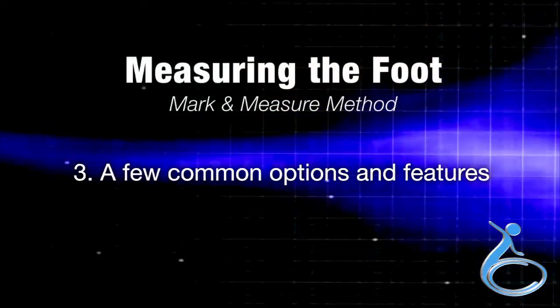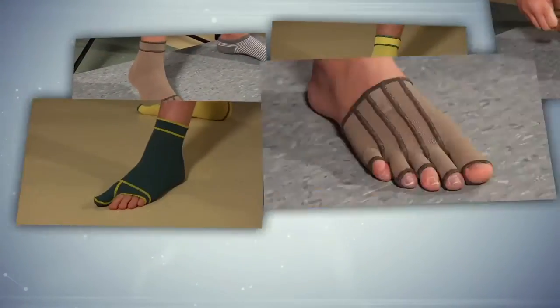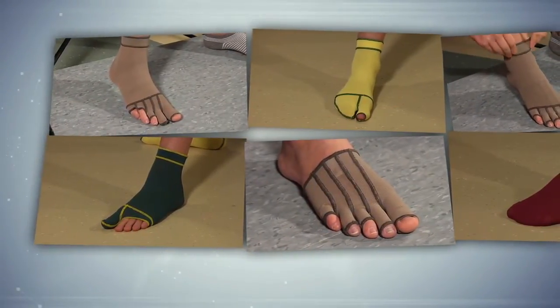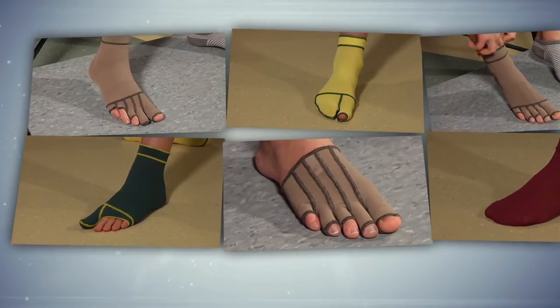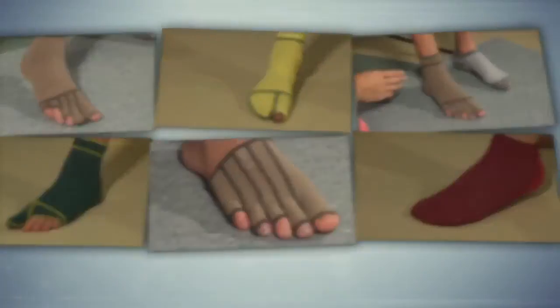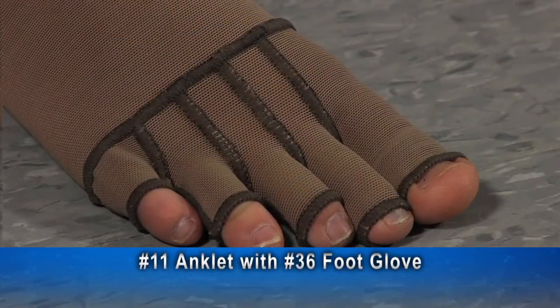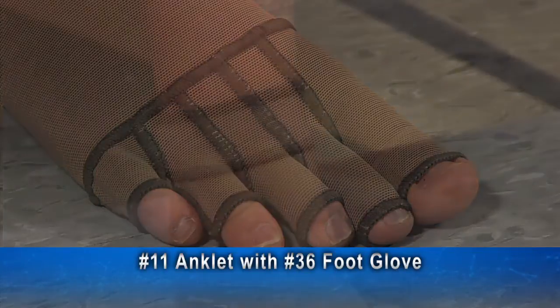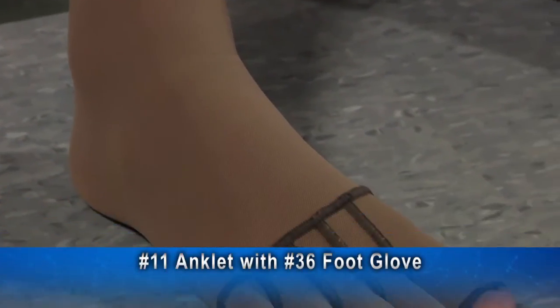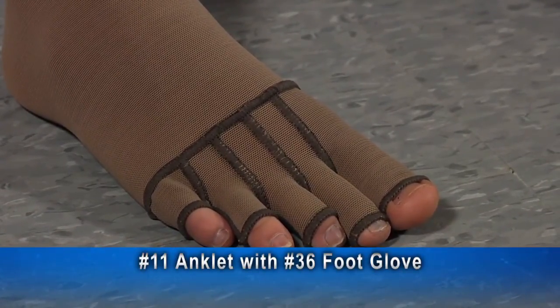We move now to Section 3, a few common options and features of the garments. Here are a few of our most commonly ordered garment styles and features — keep in mind we have many more options for every style. Consult the measuring manual for more information. This number 11 anklet has a number 36 foot glove attached to it. This example has separate enclosures for each toe, and all the toes are open tipped. Any combination of toes may be open or closed tipped, and two or more toes may share a common opening.